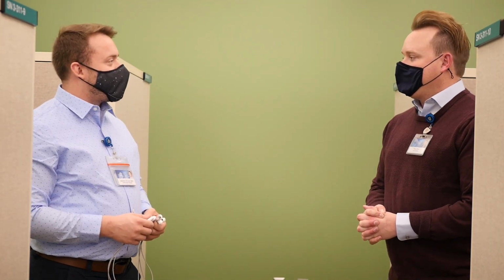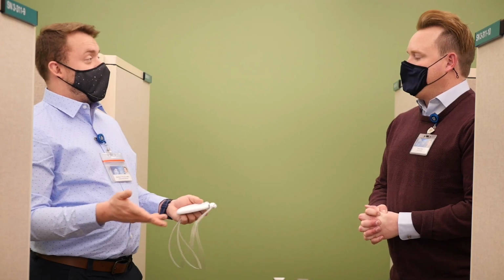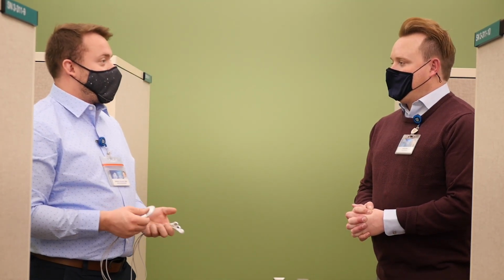Sometimes you do get weird things like that, where you notice that you're exercising, but your heart's not changing like it's supposed to, or your heart's changing and you're not exercising. That's the other thing we see, is sometimes the heart rate goes way up, and the person's sitting at home watching TV, and you're like, okay, that doesn't make any sense.